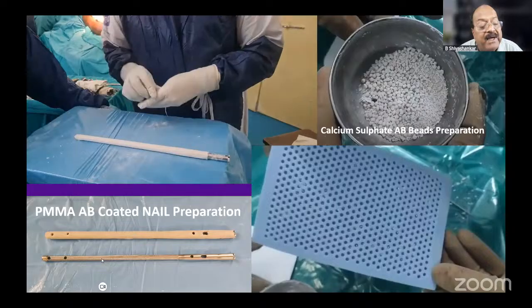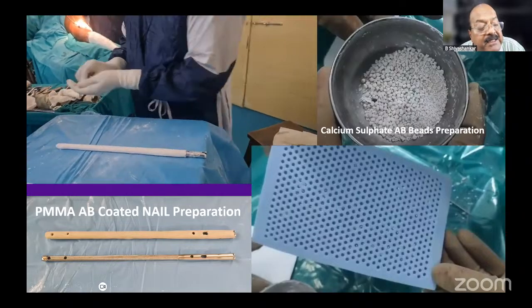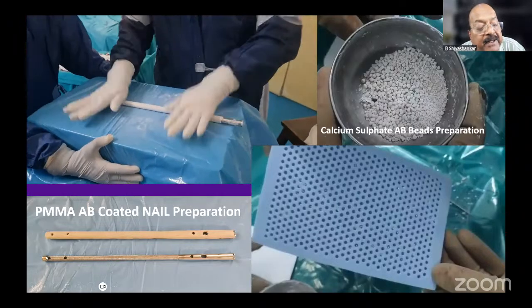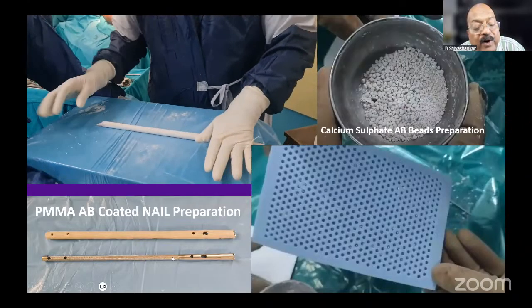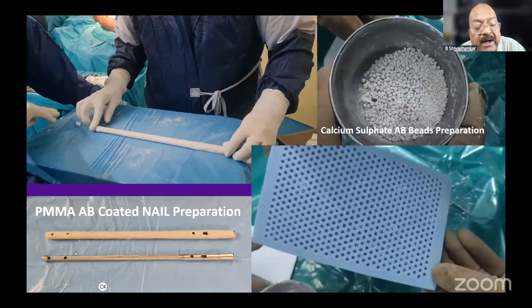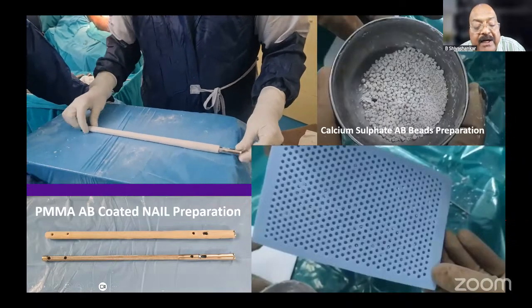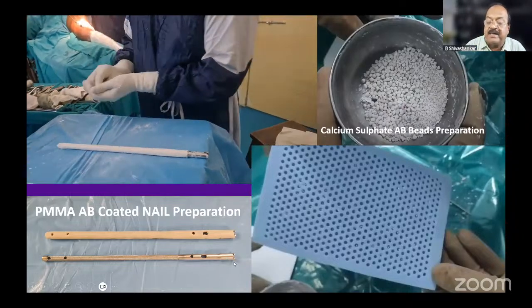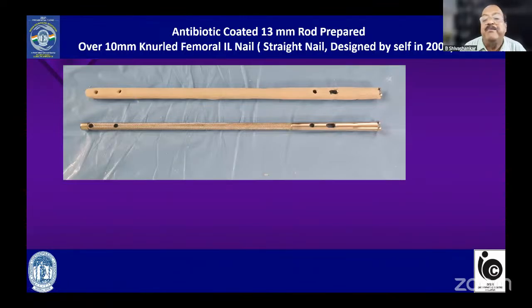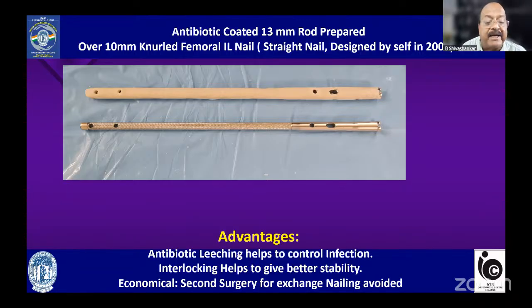So if I am using a 9 millimeter nail, the distal most part is 11 millimeter. The bulb here, the expanded portion of the nail, is 11 millimeter. So uniformly 11 millimeter cement can be obtained. If I keep this part of the nail on the table, the proximal end will be slightly conical and becomes thicker. So this is how we prepare the antibiotic coated nail, and we make the holes in the interlocking nail. There is a jig to do proximal locking, and distal locking is done by freehand technique.